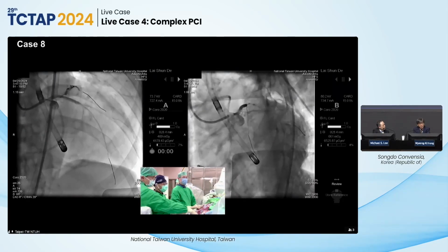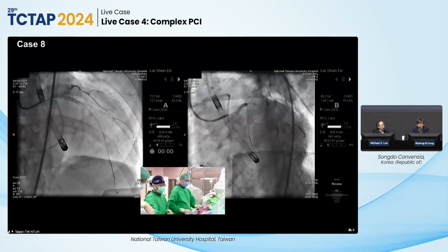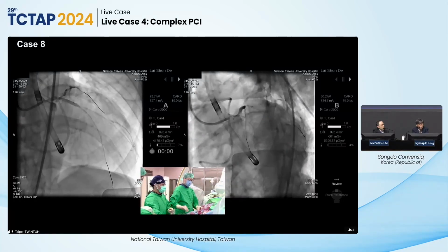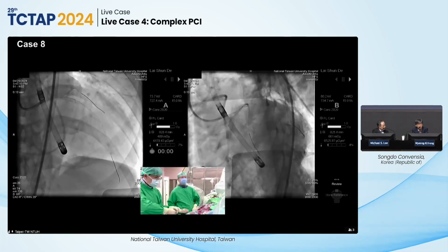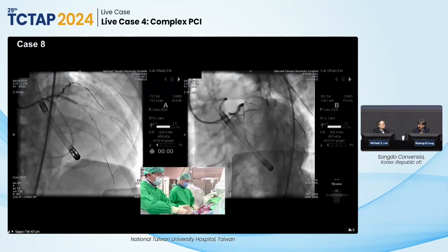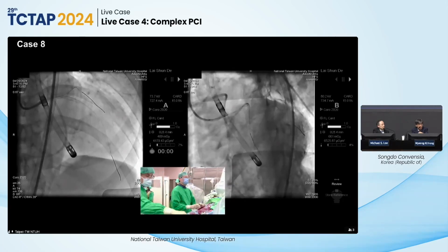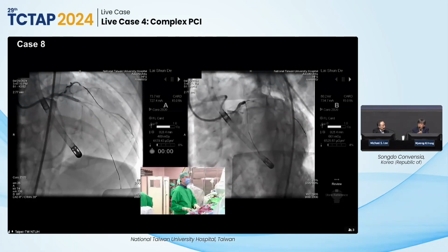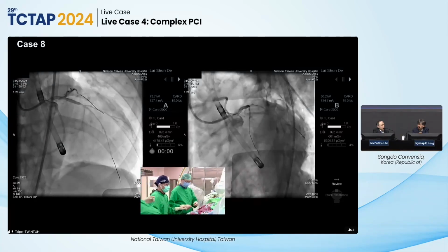I think that this is a very interesting and educational case for general practice. This is a really high risk and complex case, but the procedure itself is simple based on the result from the IVUS examination. So fix it, just a single stent. That's the main message of it. And the second one is, in the IVUS run, if there is something abnormal, we will selectively fix it, and that is the main message for this kind of patient.